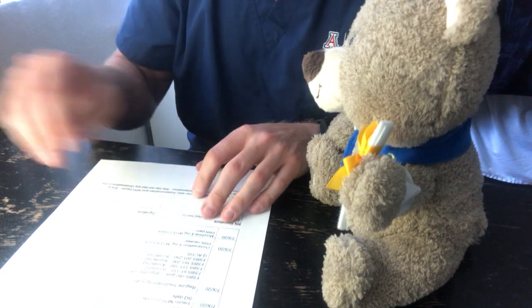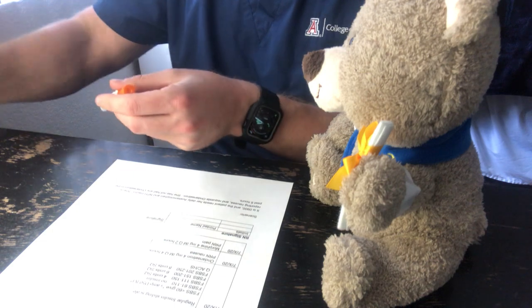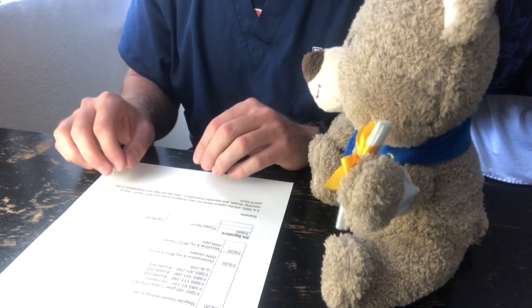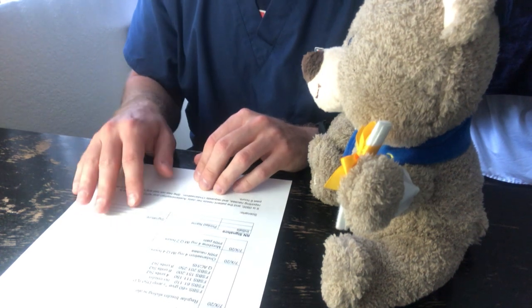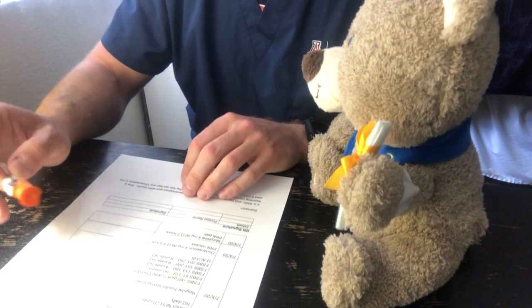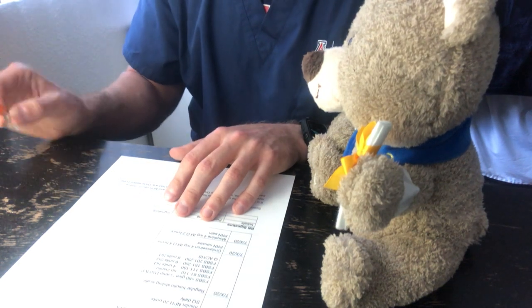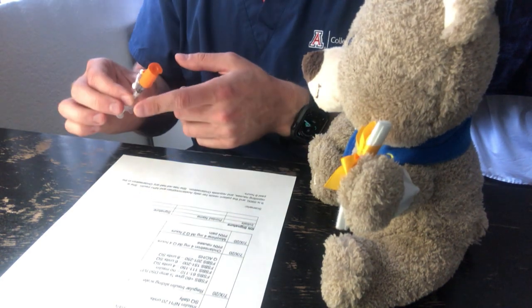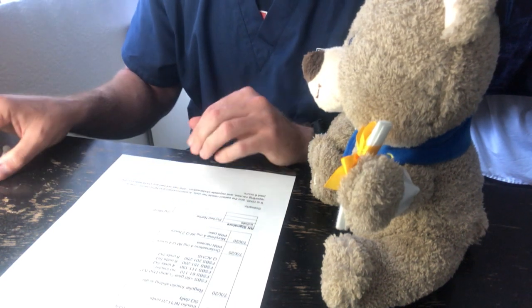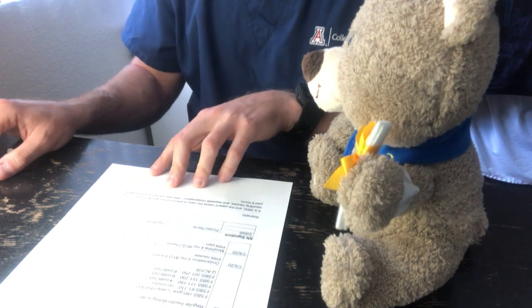I go ahead and pull it up on the MAR. I scan the insulin with the label that I put on, beep. I had trouble keeping the labels on these before, that's why they're not on there. I scan the barcode, it pulls up. I document when I'm giving the med at 9 a.m. I verify again that I have the right patient, Marge Simpson, I have the right drug, NPH insulin, 20 units, right drug, right dose. It's a sub-Q injection, so the right route. And again, the time is appropriate as the order is daily and it has not been given yet.